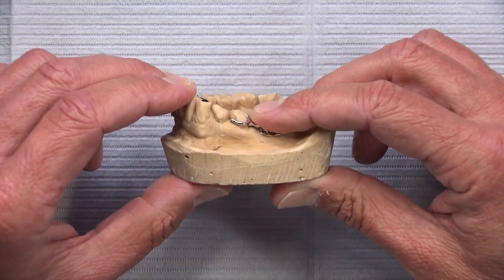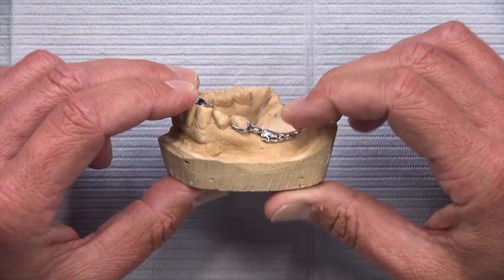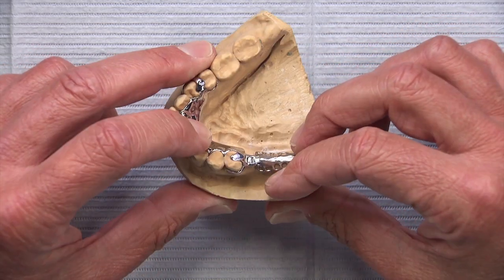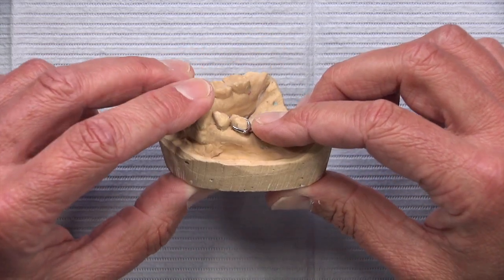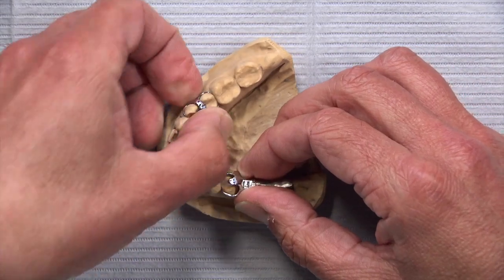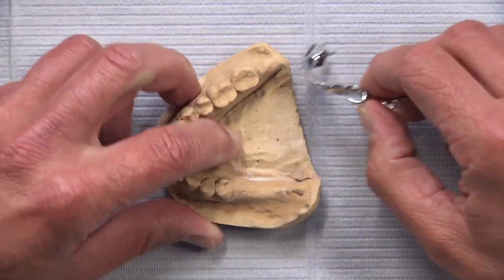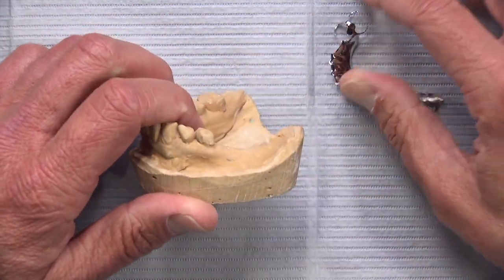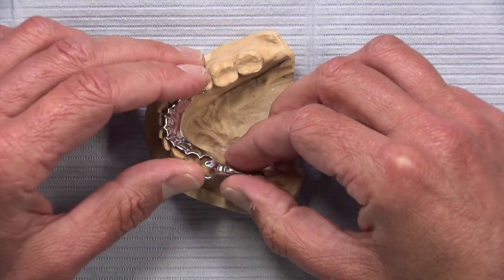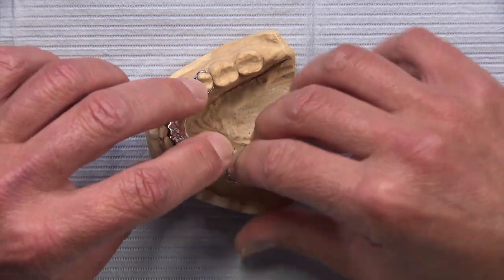One thing to keep in mind is occlusal clearance — we need room to place a denture tooth over the hinge. The lab typically needs five millimeters from the gingiva where the hinge will be, five millimeters up to the opposing. As long as that five millimeters exists, there is room for the DE hinge and the denture tooth.